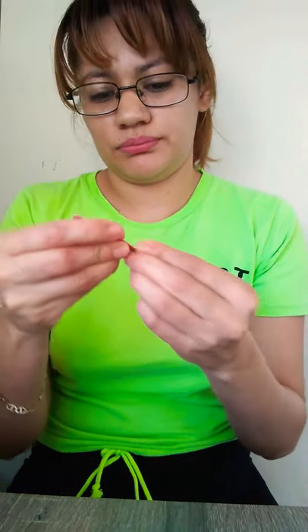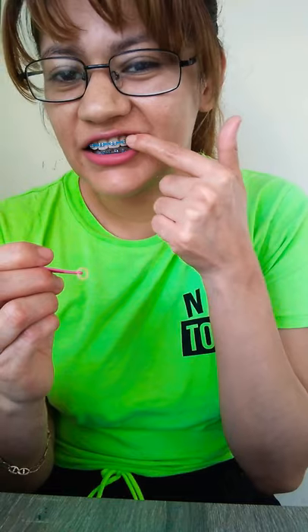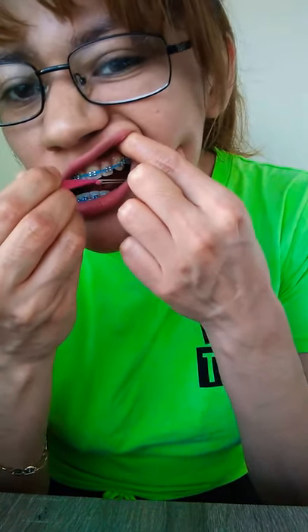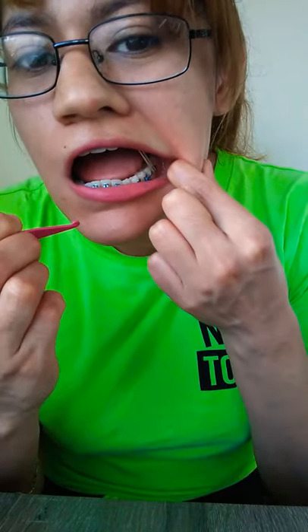So you put it on the hook like this. Let me see if I can put them on looking at myself in the camera. I'm supposed to put them on the last bottom teeth and then the last hook is up here. And there you go.